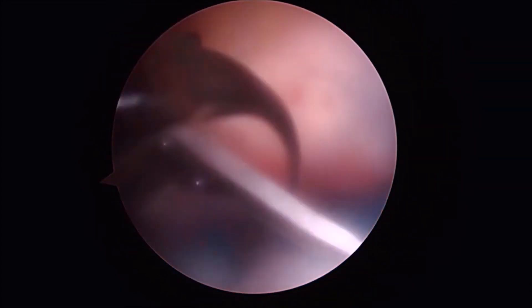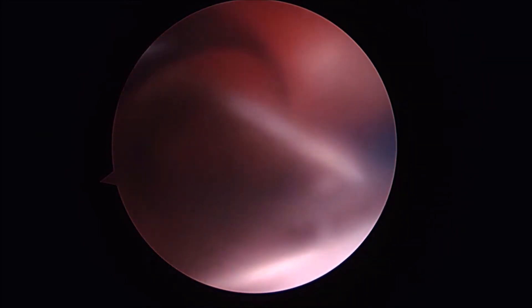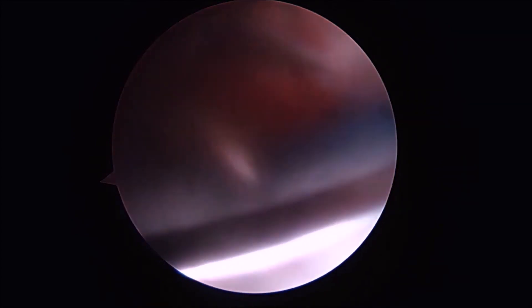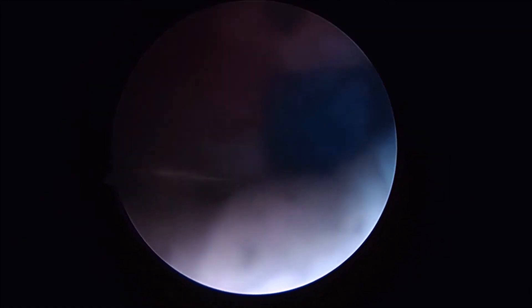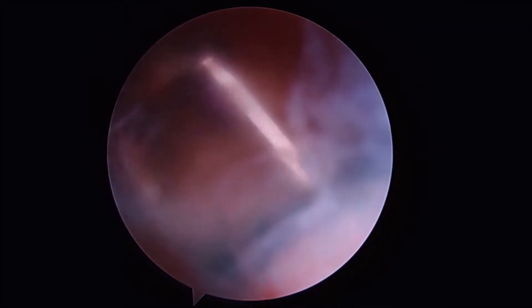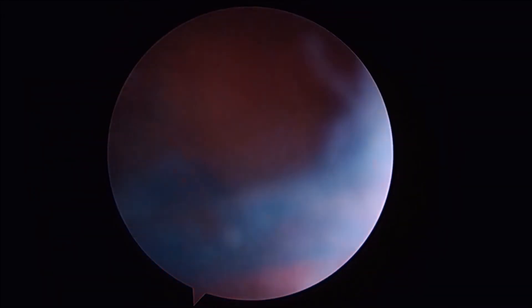An accessory portal is then utilized to place our cannula. Through the cannula we can insert our rotator cuff tendon staples which are made of PLA. The staples are then introduced through the graft into the rotator cuff. I typically tend to place my staples along the medial margin to allow for good fixation.